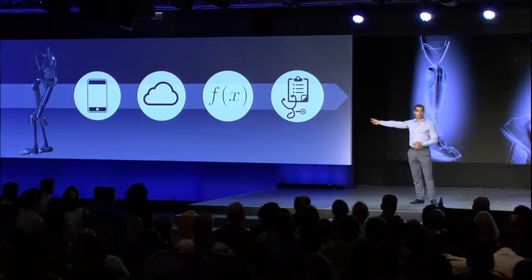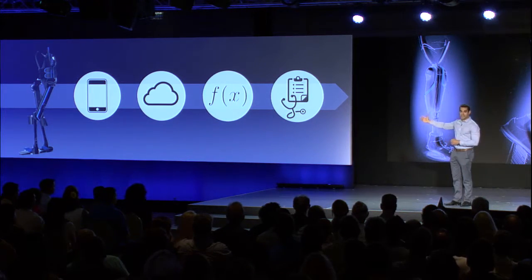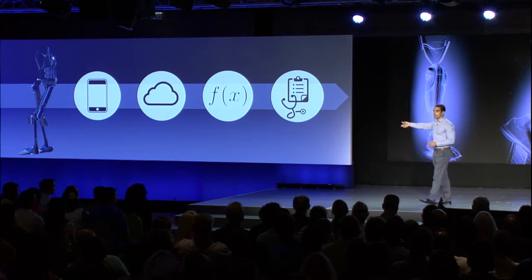We're using the iPad tablet interface to record that data. Once the data is recorded, it goes to the cloud, where you can perform a lot of analysis and analytics. We get results from that analysis, and we output those results to the doctor. So what that allows us to do is to output results and real data to the tablet that the doctor is using to control the device.